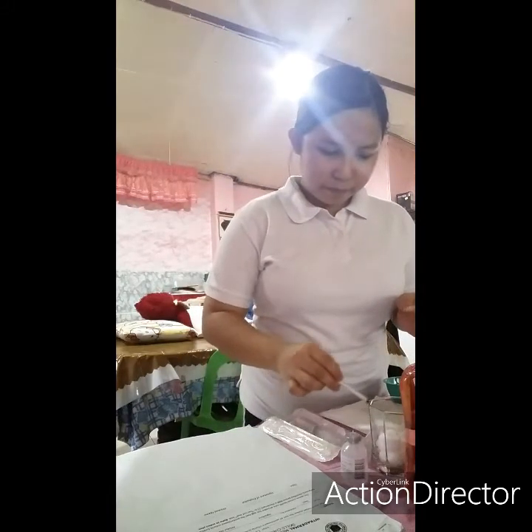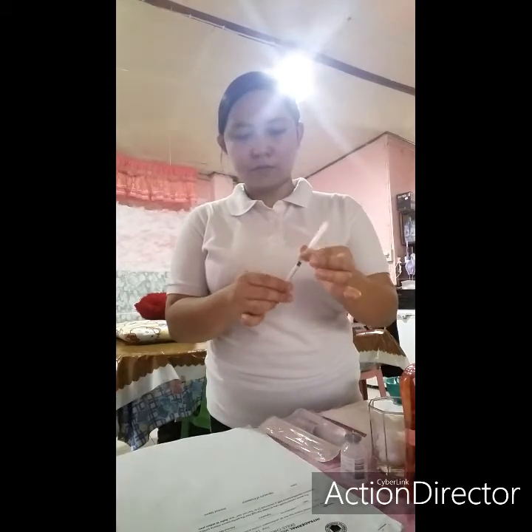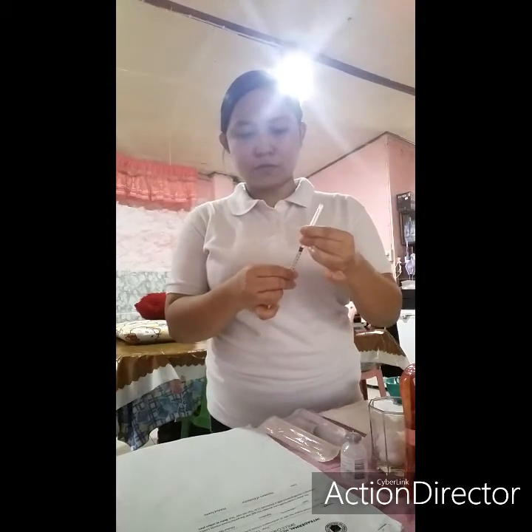Then tap. Remove the aspiration needle, then discard it, then connect the needle that we use to inject.